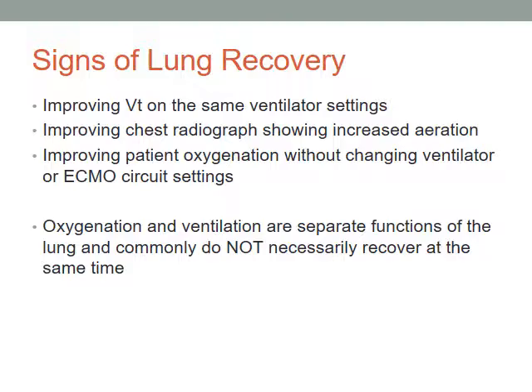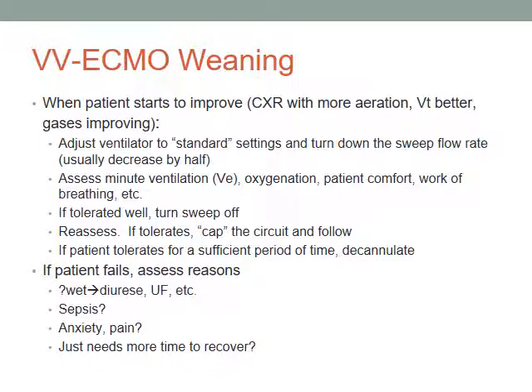When they start to improve, we change their ventilator settings, turn them back to more standard, not poisonous settings, but standard ventilator settings. I turn the sweep down by about half and see what happens. I'll watch for 10 minutes. Sometimes they fail immediately. Okay, fine. Turn the sweep back up, turn the ventilator back down, try again another day. But if they do fine, I'll turn the sweep off completely and watch.